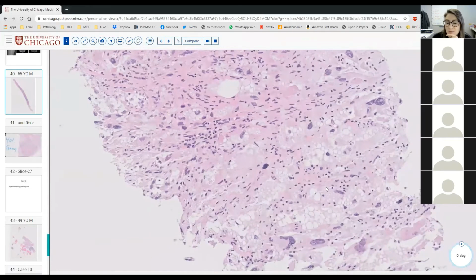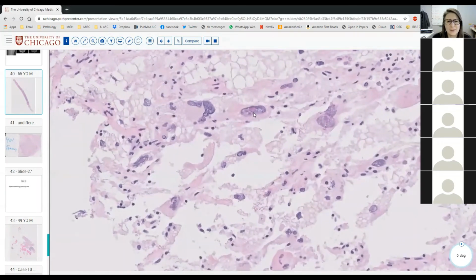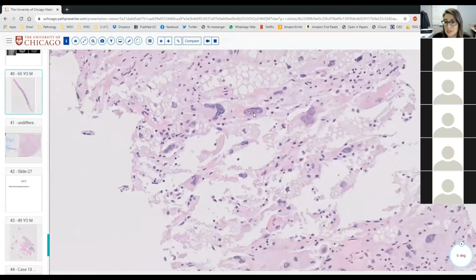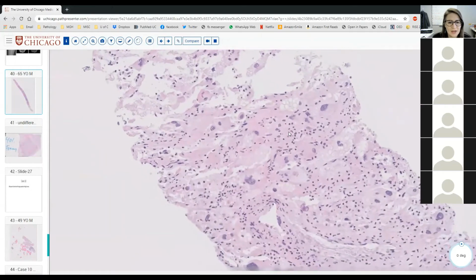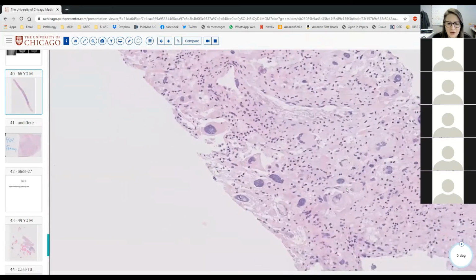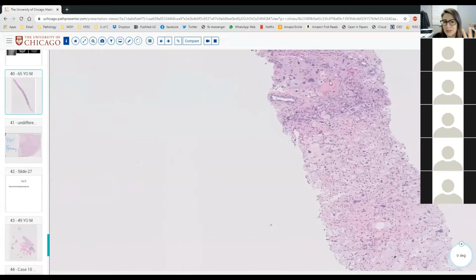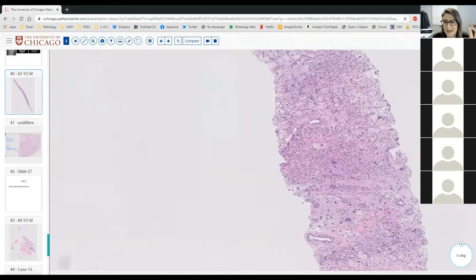So we have a deep tumor composed of these very bizarre looking cells, right? With prominent nucleoli, multinucleation, weird vacuoles. I honestly haven't seen mitoses, but the cytology here is just too bad to be benign.